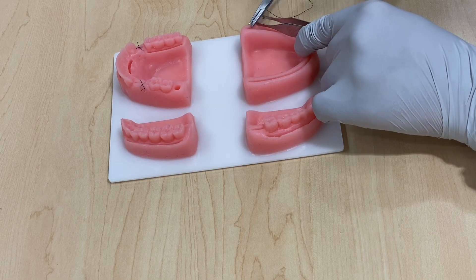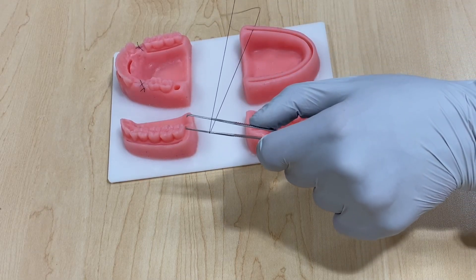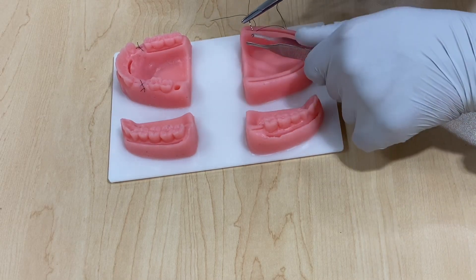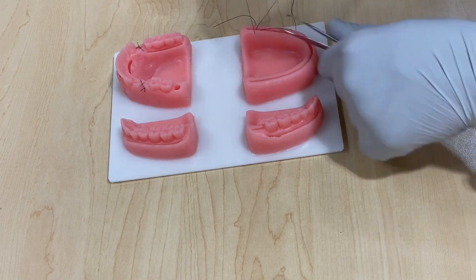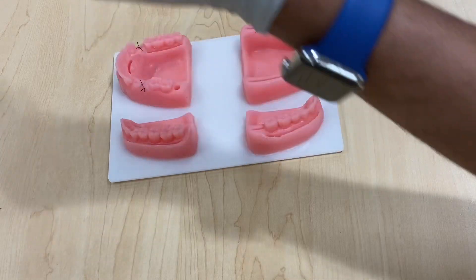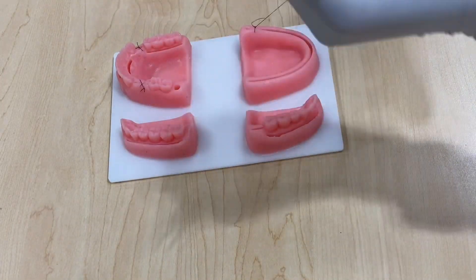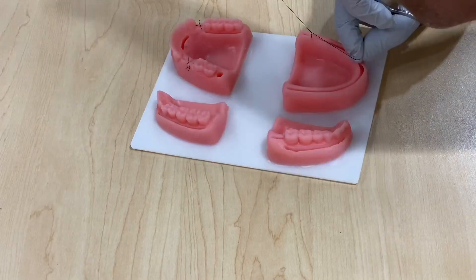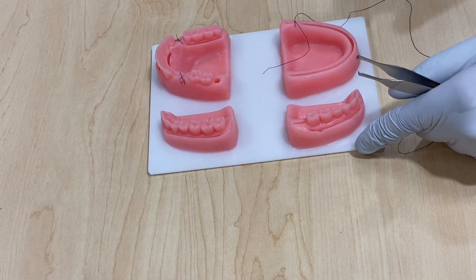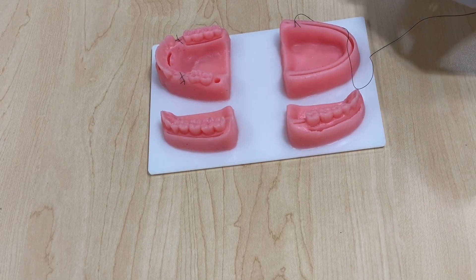Do the trick to pull it through — you have your short tail, don't lose it. Go to the lingual or palatal, just like we did. Do your simple interrupted: two loops toward the short tail, pull across; one loop toward the short tail, pull across; one loop toward the short tail and pull across. Now instead of cutting both ends, you want to cut only the short end — just the short end.